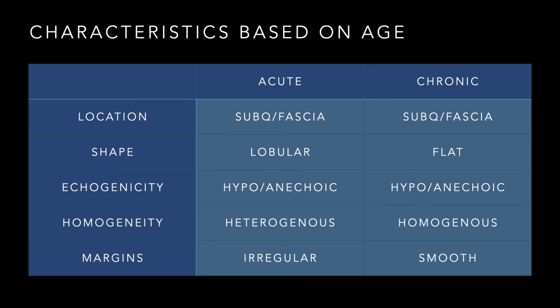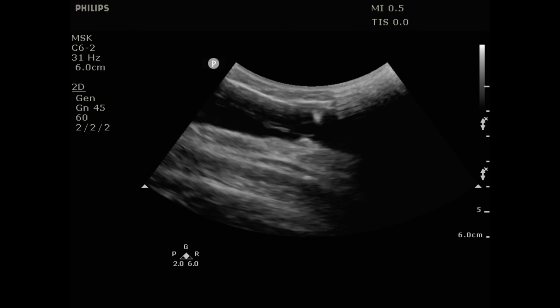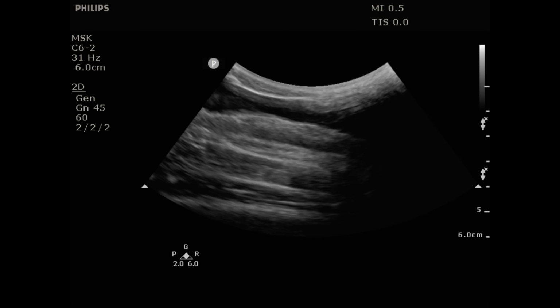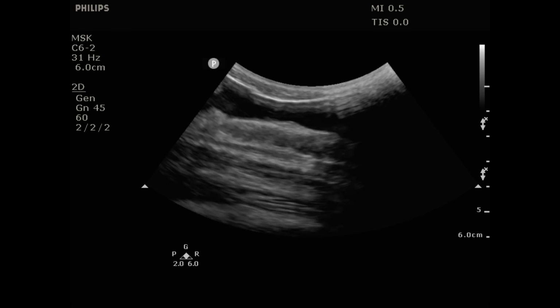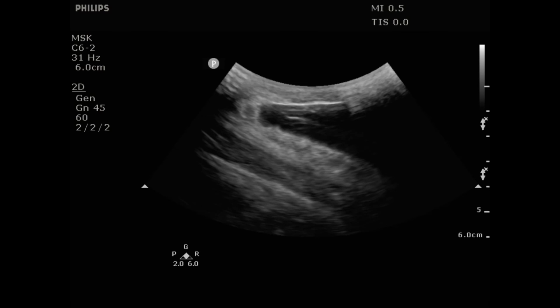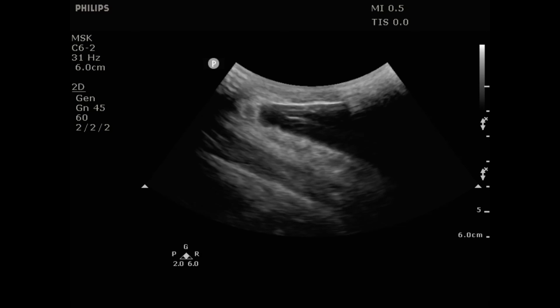So again, this is that example, that nice panoramic view of that lesion that exists between the muscle. You see that striated muscle with the fascia on top, and then that subcutaneous layer that's lifted off of that fascia, above that lesion. And if we go back to the images that we started with, we can go back and look and say, okay, I see some of the stuff now, right? It's that fusiform, that lenticular, or that long fusiform, mixed echogenicity, fluid collection, deep to that subcutaneous layer, that's above that muscle, right there.